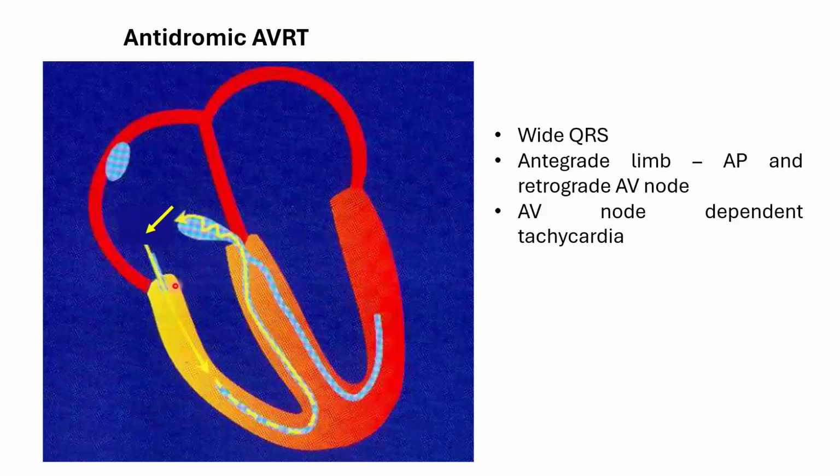So in a patient with an antidromic AVRT, if there is a focal VT or a VT exit site in the same region as the pathway's exit, then the activation of the ventricle is also in the same way as that during antidromic AVRT. So based on the QRS morphology alone, we cannot clearly differentiate between an antidromic AVRT and a VT arising from the same region.